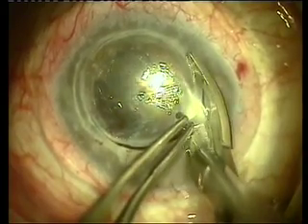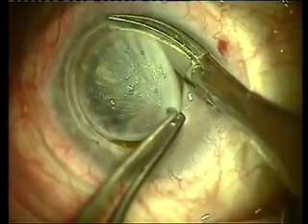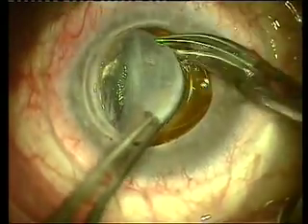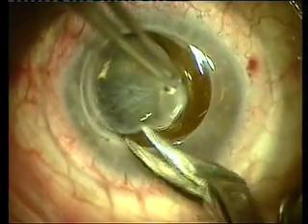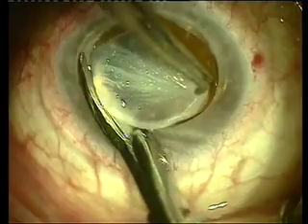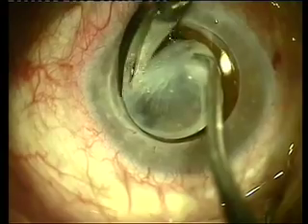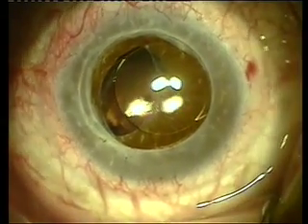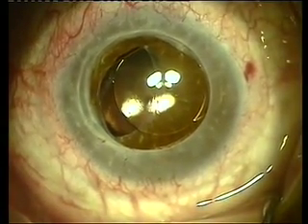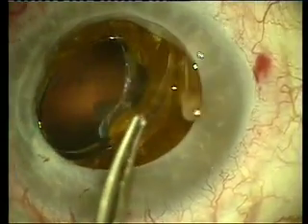We're placing viscoelastic into the anterior chamber, completing our trephination with cornea scissors. As you can see, our trephination is placed more centrally towards the cornea center. Removal of the failed graft and now we can see the anterior chamber intraocular lens.